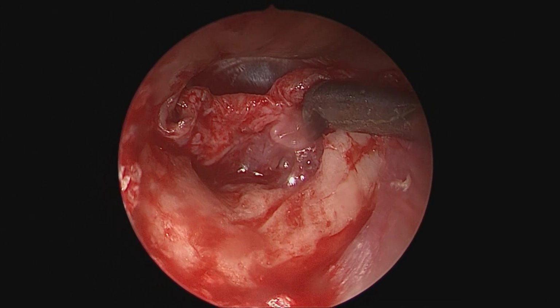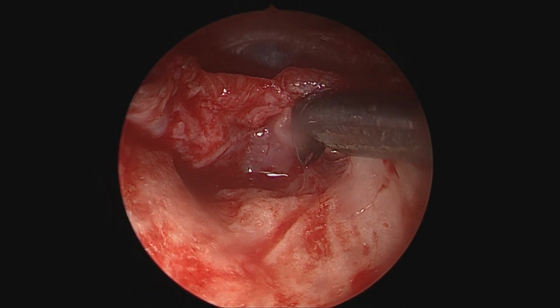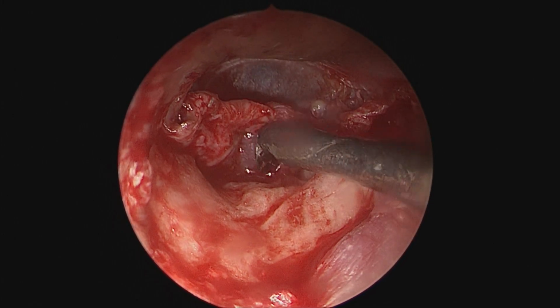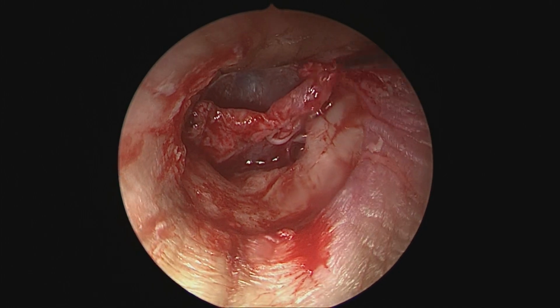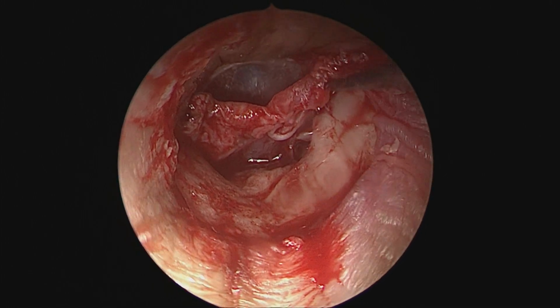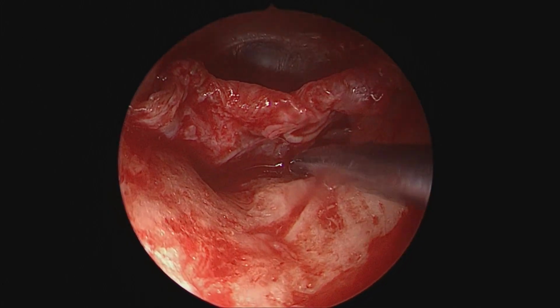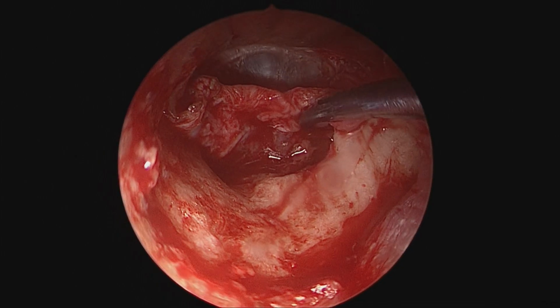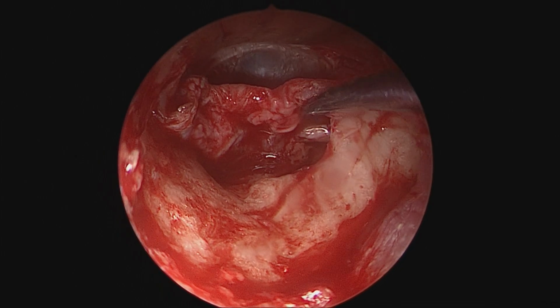And as we see, we are taking utmost care to elevate the entire canal skin with the tympanomeatal flap in toto to avoid missing any epithelium or gross disease that goes inside the posterior mesotympanic recesses. Now we resort to a sickle knife to gradually tease off the tympanomeatal flap and sharply dissect any mucosal adhesions that could compromise our flap elevation. You could see this is already the incus, long process.